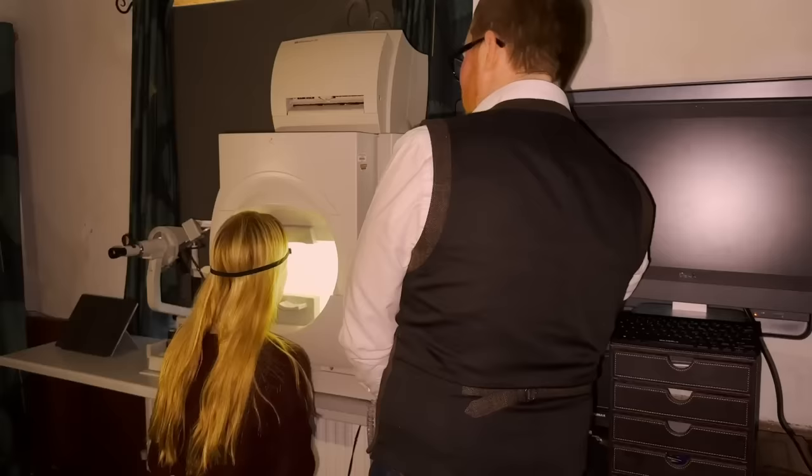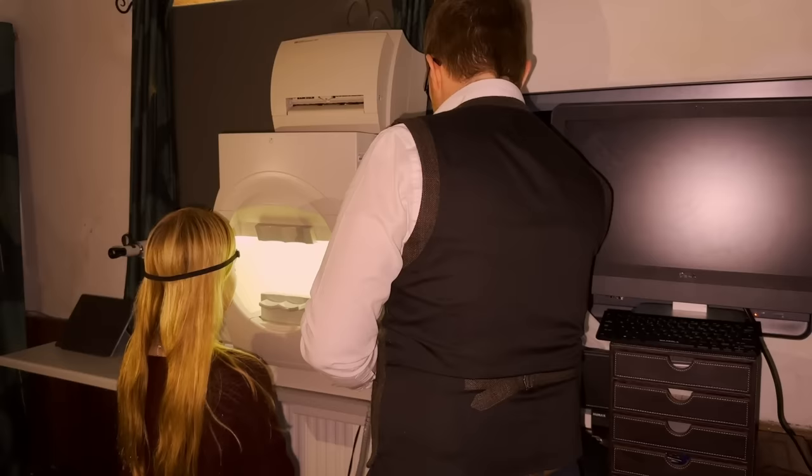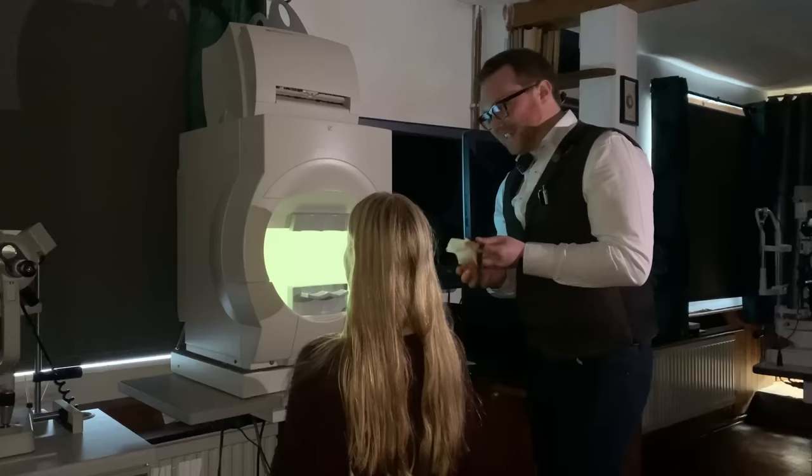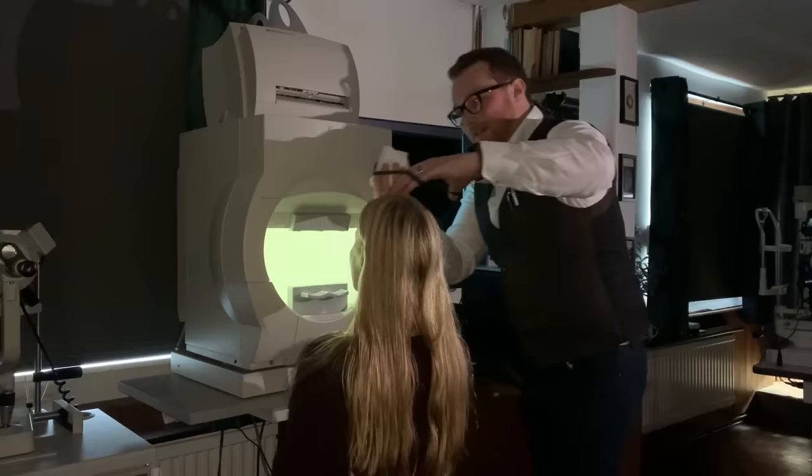Brilliant, proper workout for your eyes there, that was very good. So that's good. Right, so if I take the clicker, what we're going to do is move that patch to your other eye. So just pop that off. It'll feel a bit blurry because you'll have had a patch clamped over that left eye. So let's just pop that patch in your right eye.